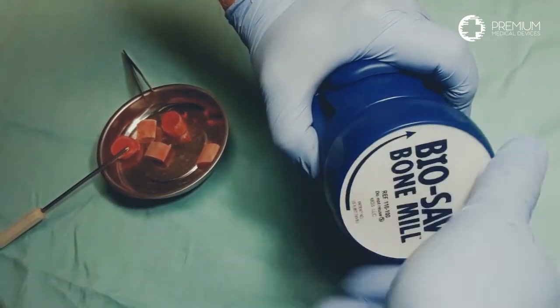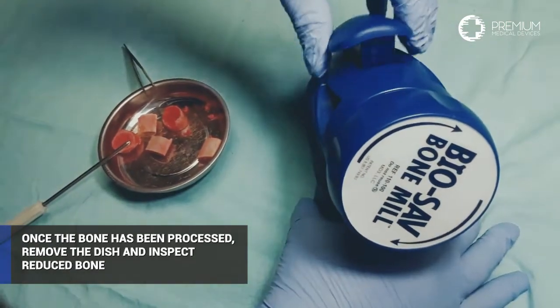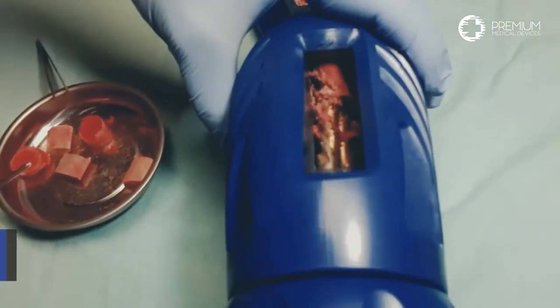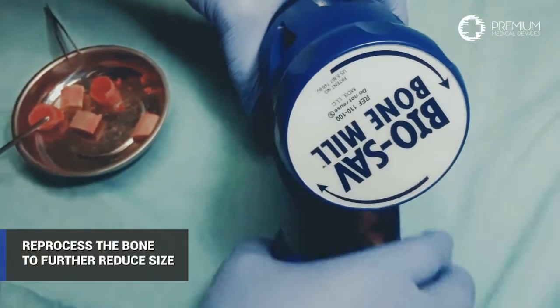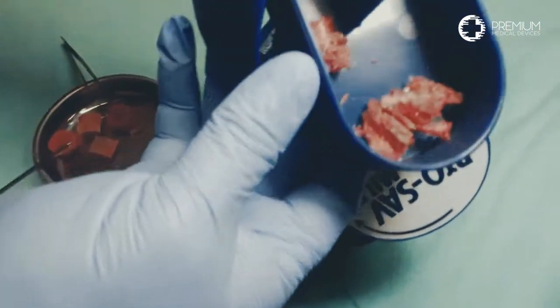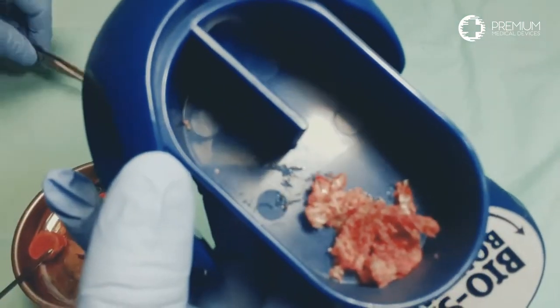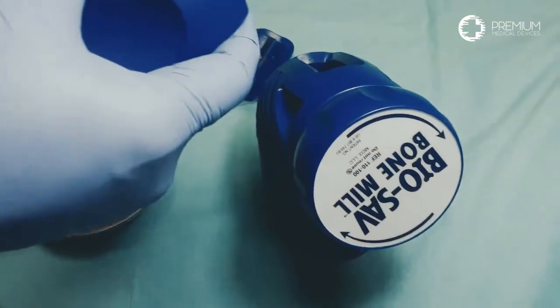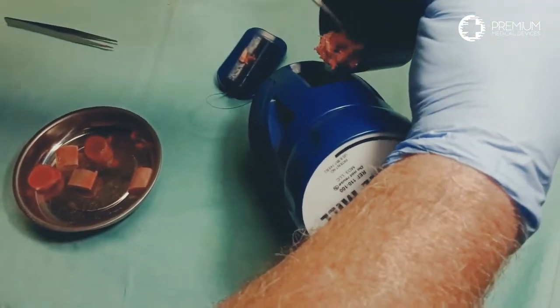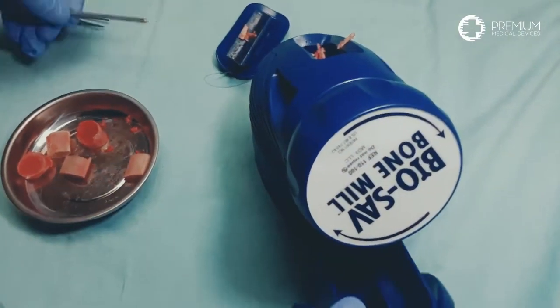Once the knob of the mill no longer resists turning, it is likely all the bone is reduced. Pull the lower tray out to see if the bone is at the desired size. For the purposes of this video, we will reduce the bone one more time to achieve a small bone size. You will notice after the first pass that a granular size of 3 to 5 millimeters on average is achieved. For foot and ankle procedures this may be ideal; however, for spine applications this size is likely too large and needs further reduction.